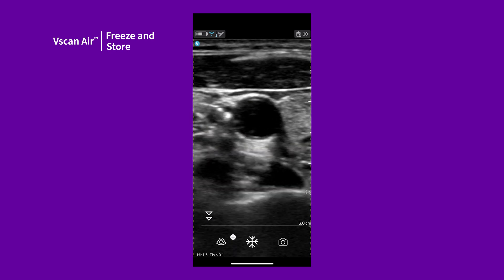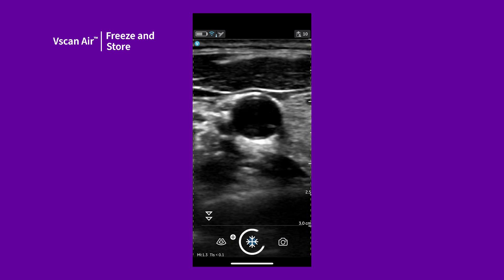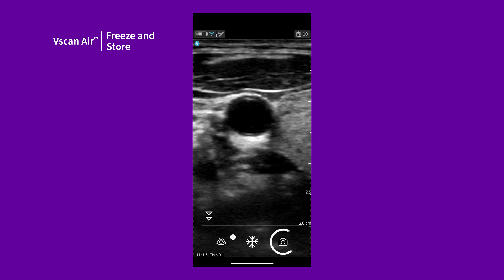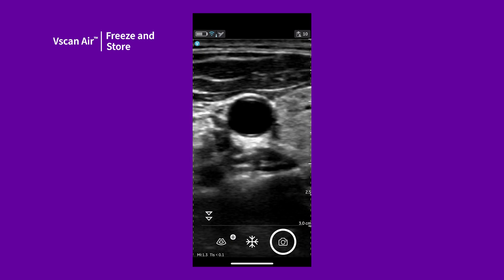Once a desired view has been obtained, you can save a still image or a video to the gallery. Tap Freeze and then the Store button to save a single frame. If you tap Store during live scanning, a video clip with the frames you just viewed is saved.